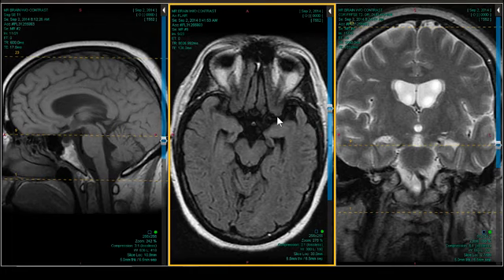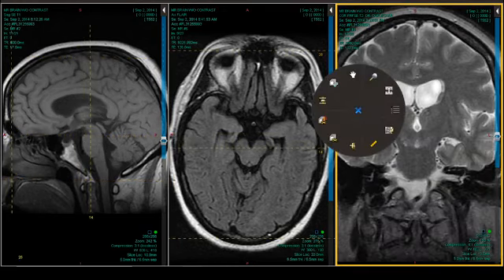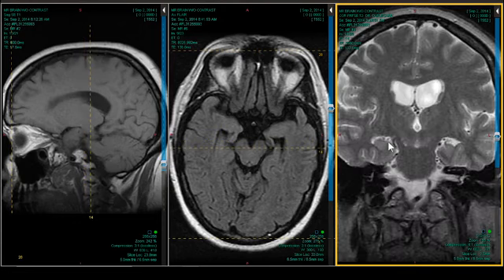These divisions are a little bit artificial. But this person, within a couple of years, had really progressed to a major dementia, right? So is it Alzheimer's? This shows that those divisions are maybe useful, but there's overlap and it can start anywhere. And this happened to start in the temporal lobe, wherever else it ended up, okay? And it started as a speech problem.